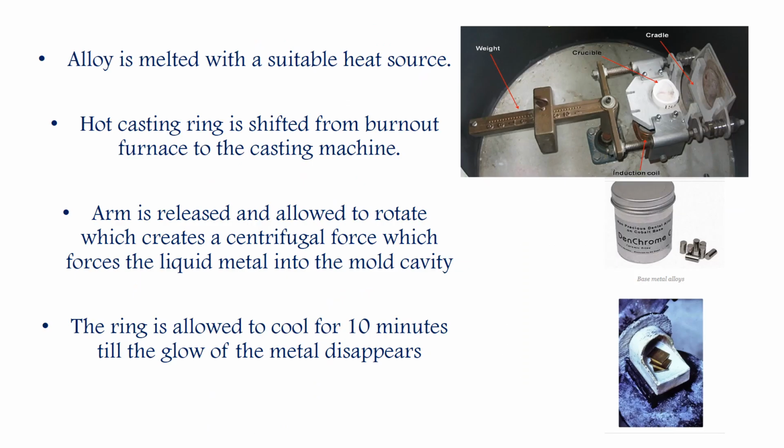So what happens in casting is, first of all, these are your metal alloys. This is your alloy, you have to keep that alloy and melt it.